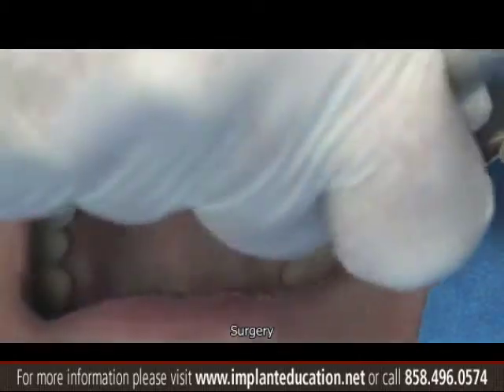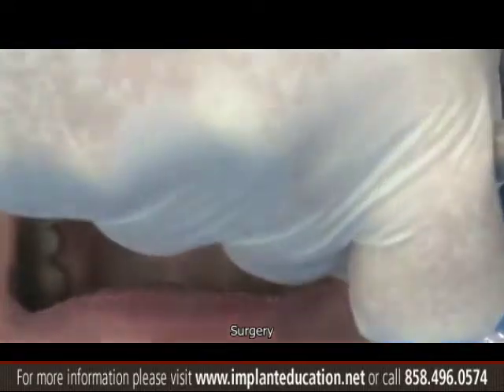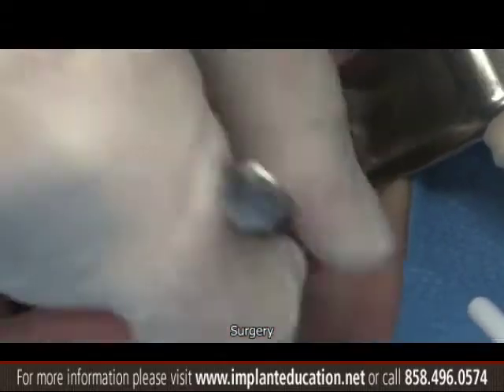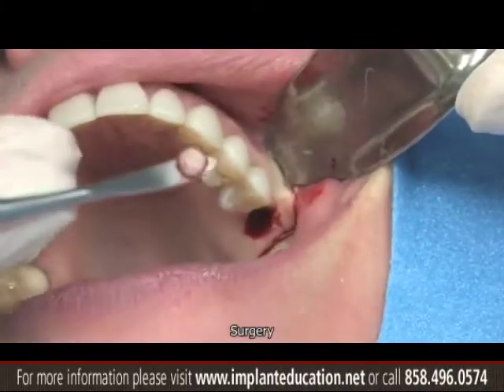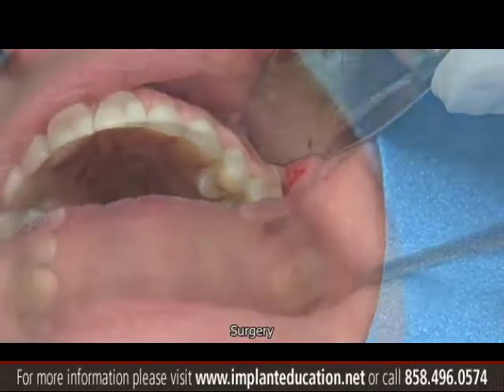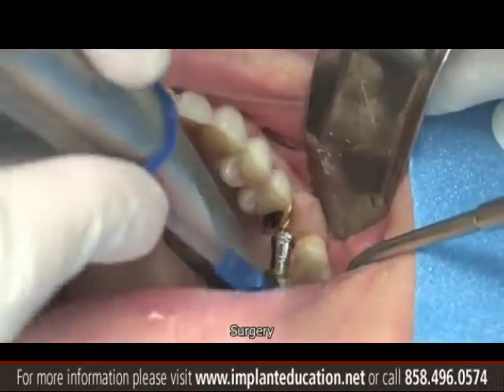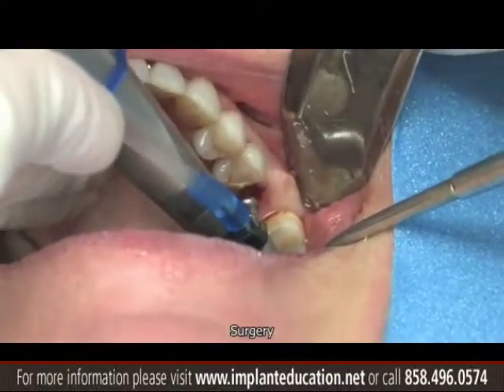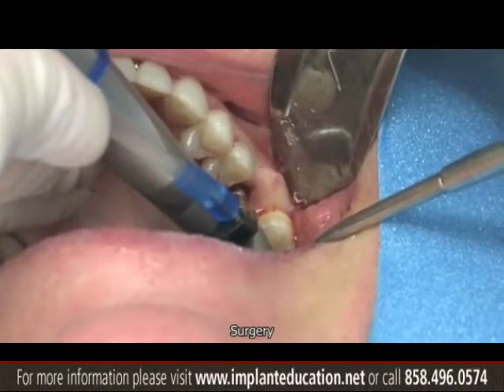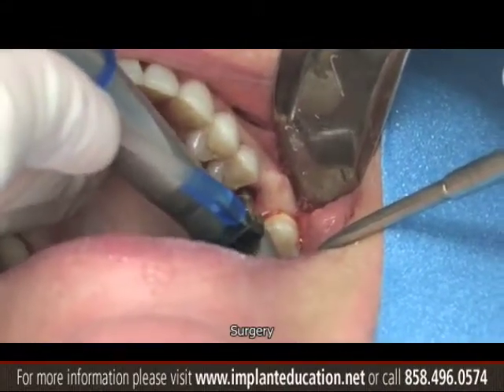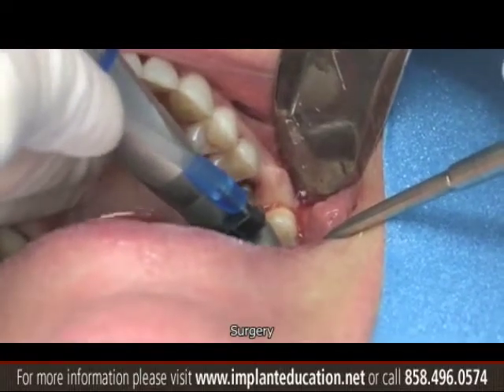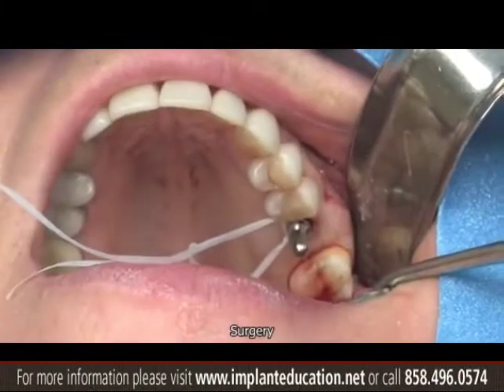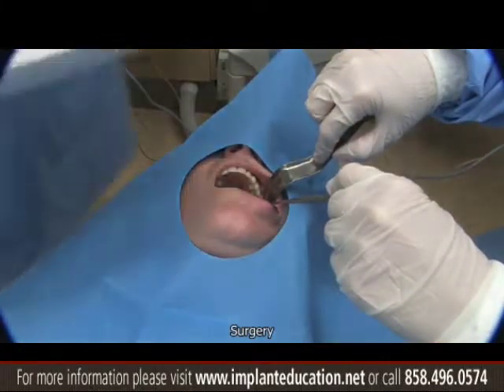After going all the way to bone with the tissue punch, we use the periosteal elevator around the periphery of this circular cut and remove this tissue plug using a Molt 9 elevator — a very clean cut. No matter how poor the density is, you always need to start with a 2.0 drill at 2,000 RPM with copious irrigation. We put a 10mm stopper on the drill and go only around 8mm into bone, with roughly 2mm of soft tissue thickness, drilling all the way to the sinus floor without penetrating it.